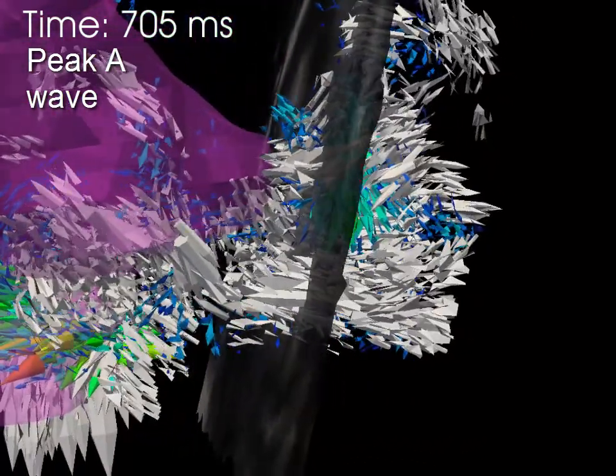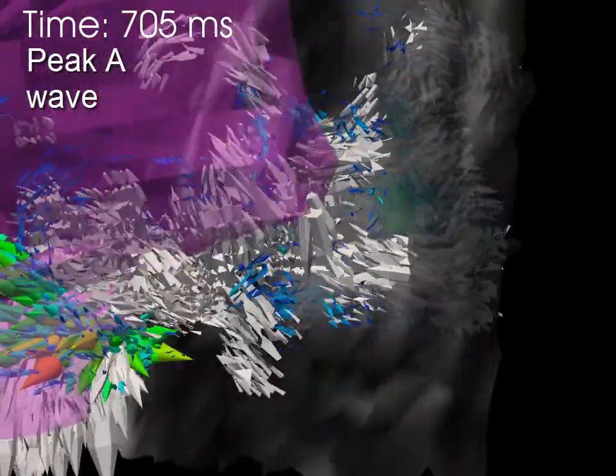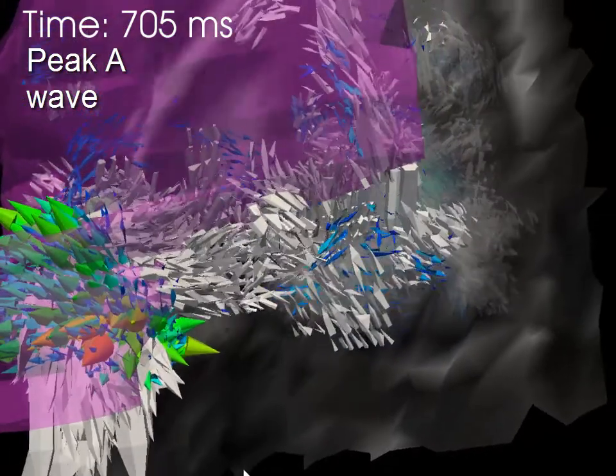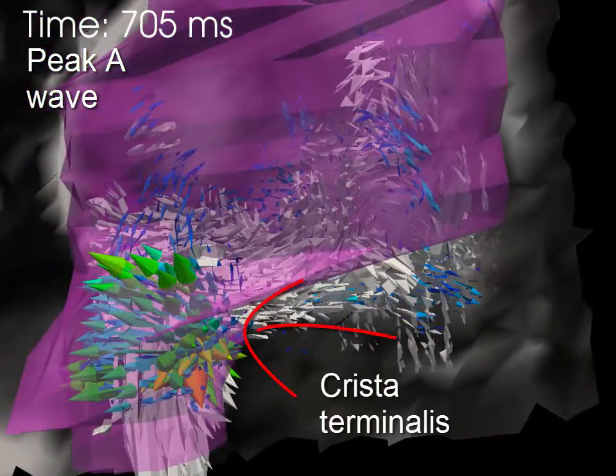This flow also generates high vorticity at the crista terminalis.